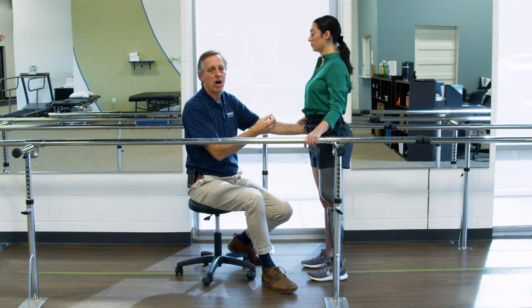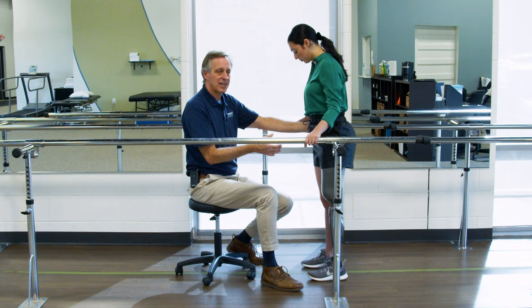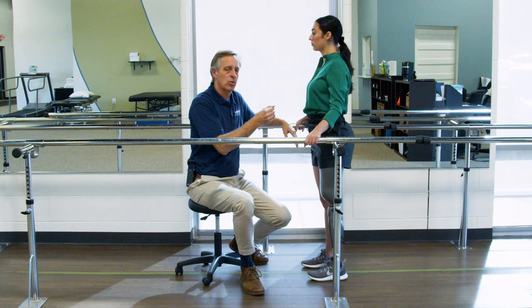All right, so we want to work on that control and open up someone's life without going all the way to running, just simply a long step walk versus a short step walk. So if someone's walking normal steps, we've kind of taken you through that process. But the first thing I want to teach Tracy is something called a chop step. And a chop step is a very short, fast step.